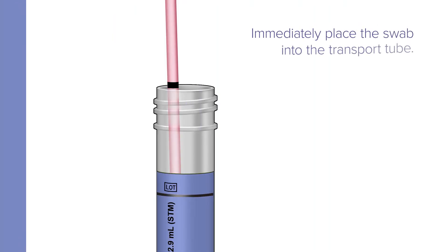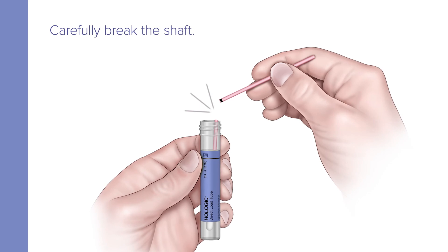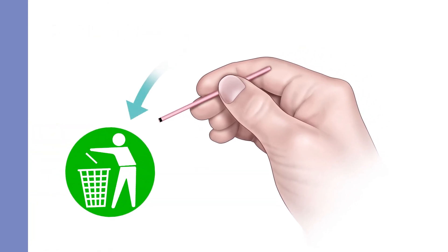Immediately place the swab into the transport tube so the black score line is at the top of the tube. Align the score line with the top edge of the tube and carefully break the shaft. Discard the top portion of the shaft.